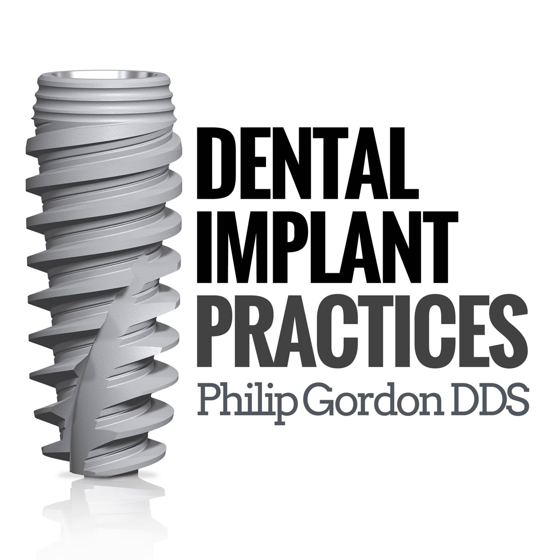And the kit consisted of 12 blades, 700 XXL burrs to cut the groove, a channel measure because you measured the depth of the channel, a seating instrument, and a mallet. That was the kit in 12 different shapes of blades. And these were one-piece implants. Anyhow, we were kind of upset that we had to buy the kit, but it made us make a commitment.